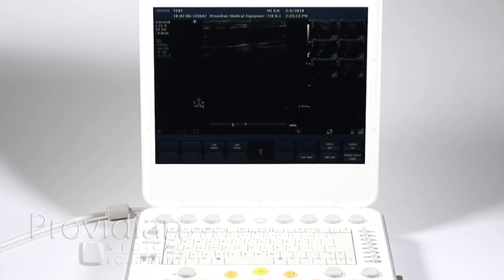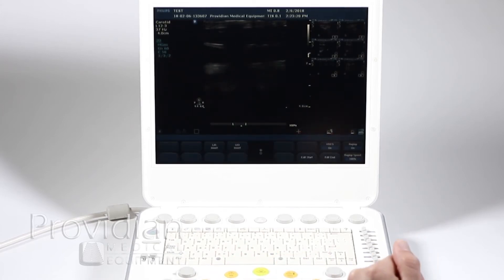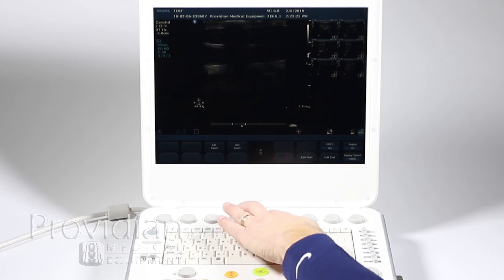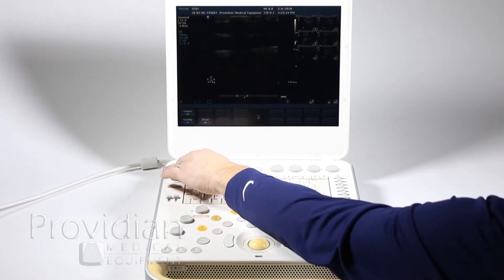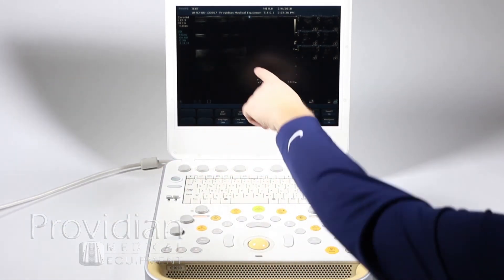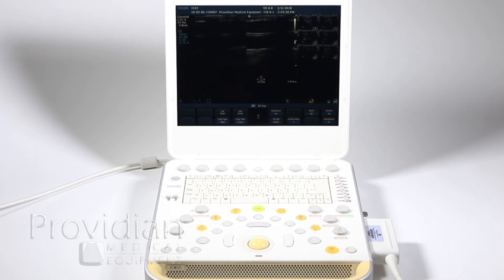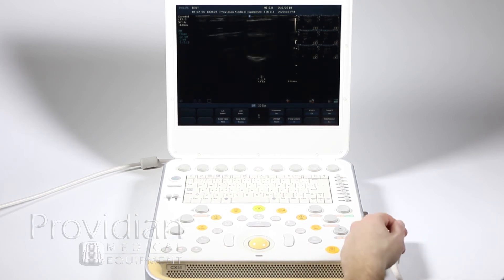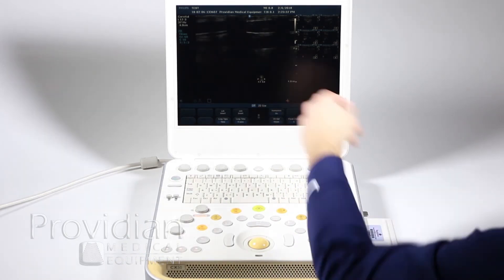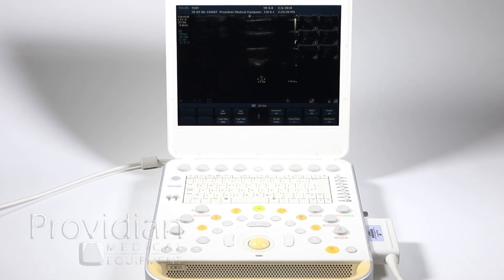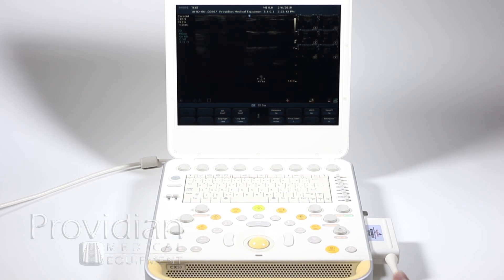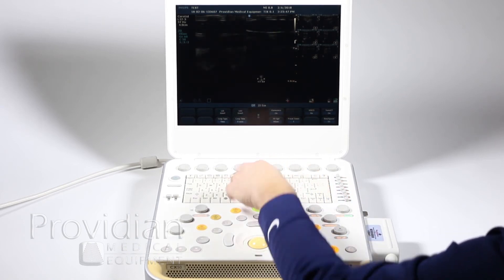Let's hit 2D and get out of that, and let's choose something called Compare — that's on the second page. If I hit Compare on, it's going to give me that, and now I have a live image on the right-hand side and I can compare those images. Obviously for Cardiac that would be more applicable, or maybe a color Doppler on here for 2D.